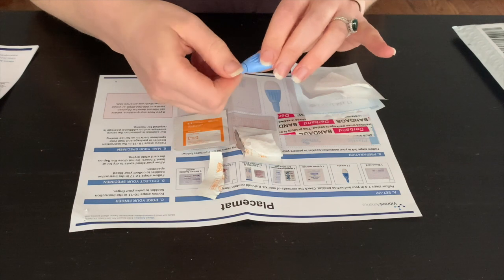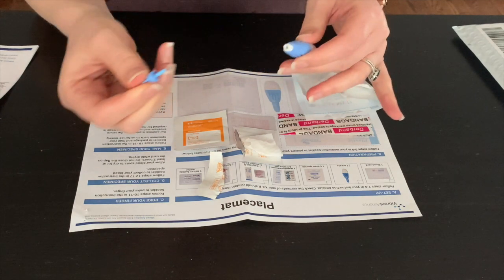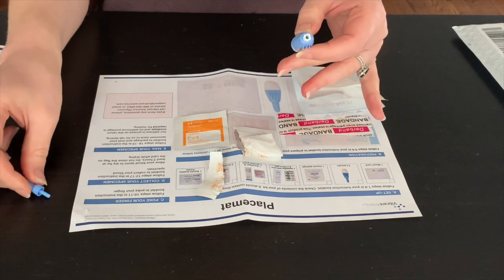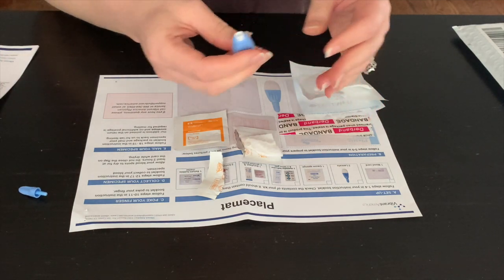Choose an area on the side of your finger to poke. If you poke the pad of your finger you may have a harder time getting blood to flow. It is recommended that you choose the side of your finger.